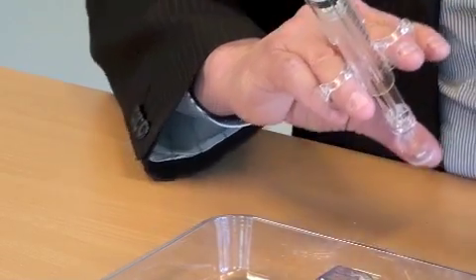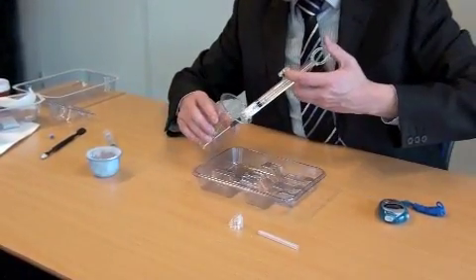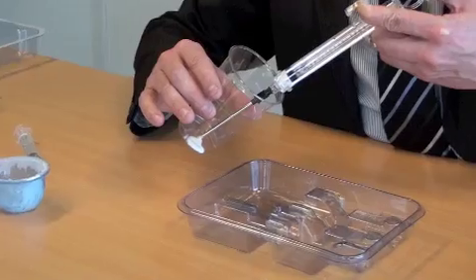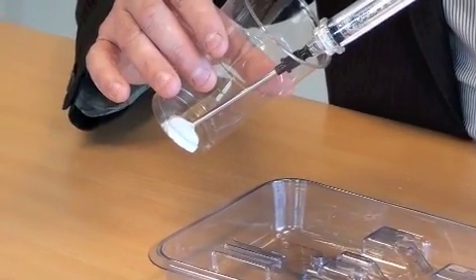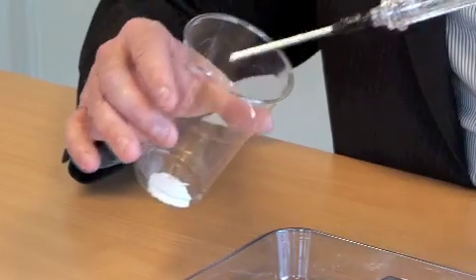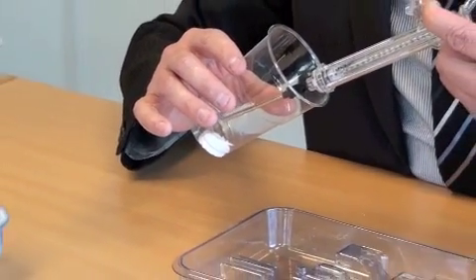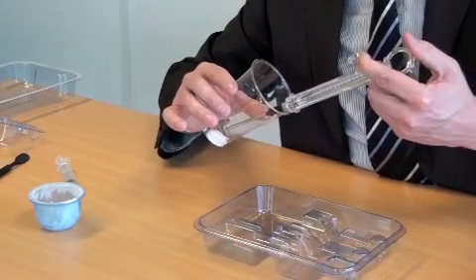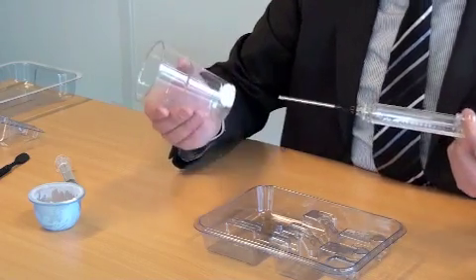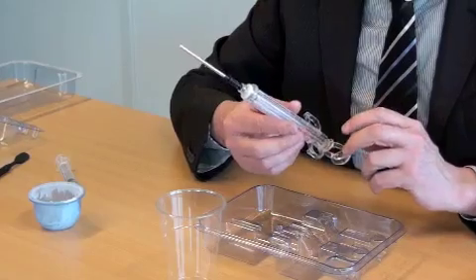It is 2 minutes and 45 seconds. I took a little bit more time, but I still have up to 4.5 minutes to inject. And now I'm going to inject it into the void under fluoroscopy. And you will see that it goes nicely into the void. When the surgeon is putting the cannula in the void, of course it should not stick the cannula into bony tissue, because then it blocks the injection. So it has to provide the possibility to inject it into the void. So now everything is injected into the void and the surgeon is ready.